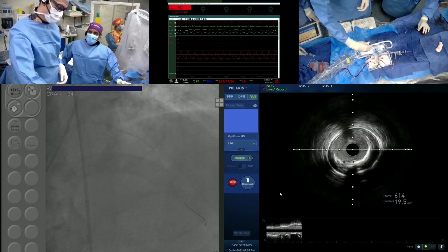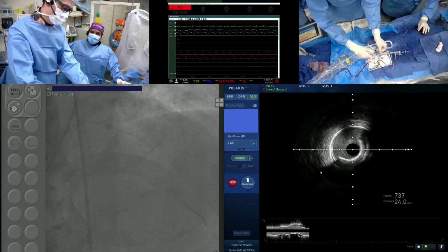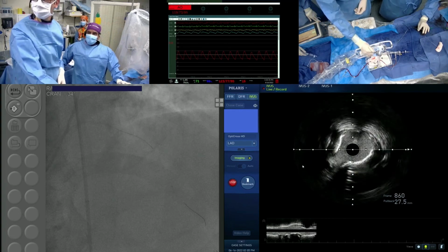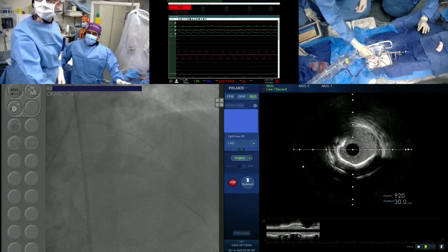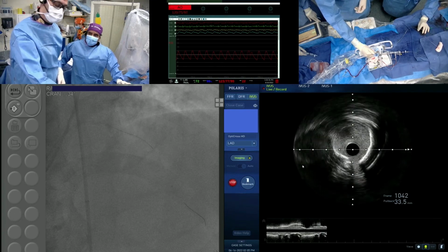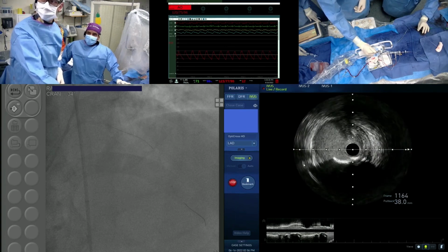So Greg, your point is that it's not a very deep calcium, it's superficial, and we have made some cuts. I see that. And in this area, it's not a full 360 degrees, only 180. Now we are getting a little higher. This was the one where we got a good lumen of maybe 2 millimeters. It was 1.75. This is the aneurysm part.